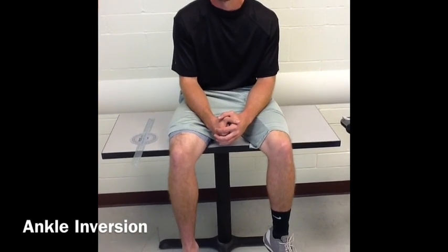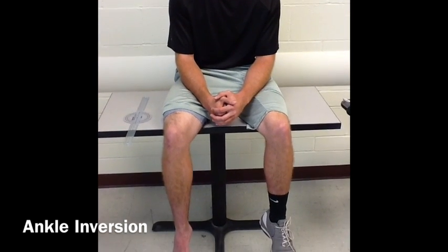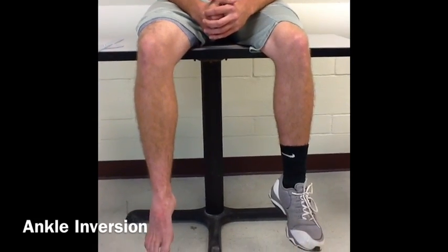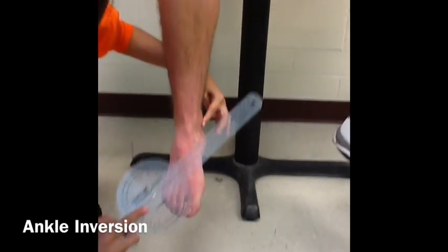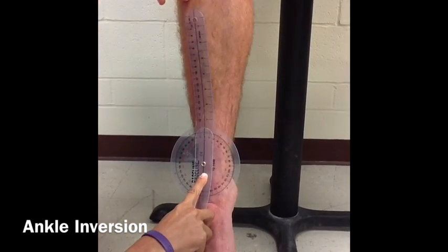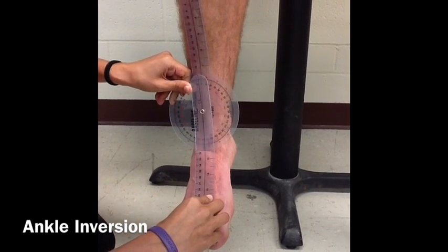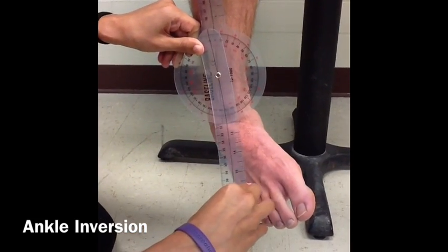Now, we will be measuring inversion of the ankle. You will need a goniometer and one patient. Make sure your patient is in the short sitting position with their legs off the table. Align the goniometer with the ankle, making sure the fulcrum is arranged between the two malleoli. The stationary arm should be in line with the midline of the tibia, and the movement arm should be in line with the second metatarsal. Then instruct your patient to point their foot inwards and measure the range of motion.